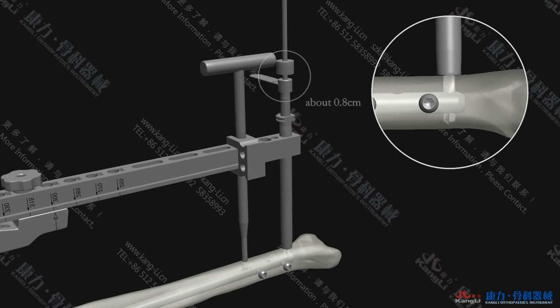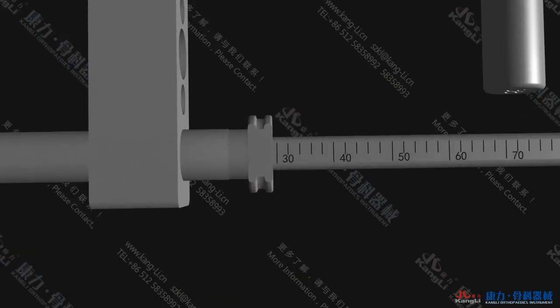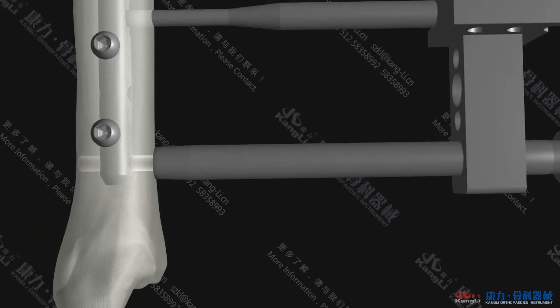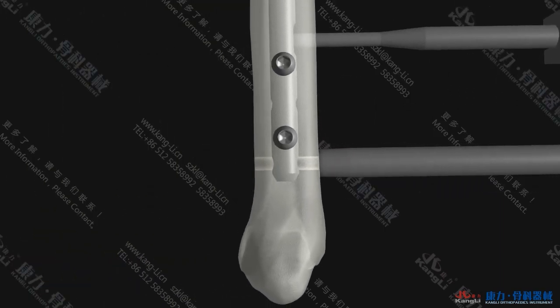Then continue drilling until the contralateral bone cortex is drilled through. Remove the Φ4.0 inner sleeve and Φ4.0 drill bit. Keep the outer sleeve closely contacted with the bone cortex and insert the guide depth gauge to measure the diameter of the bone. Choose the Φ4.5 locking screw with appropriate length and screw in with the 3.5 hexagonal screwdriver.